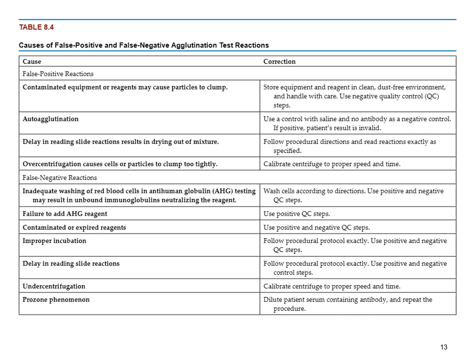We're really going to dive a little bit deeper into this once we get into our immunohematology blood bank course. Some of the more obvious things will be not adding your reagents, not properly centrifuging, not allowing the appropriate amount of time for the test reaction to take place, allowing it to sit too long, or not reading it soon enough, as well as something we call a prozone effect. So review these and see what the outcome is, and as we get into our immunohematology course, we're going to talk about these things a little more in depth.